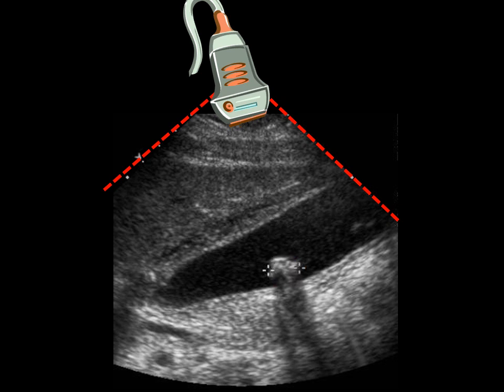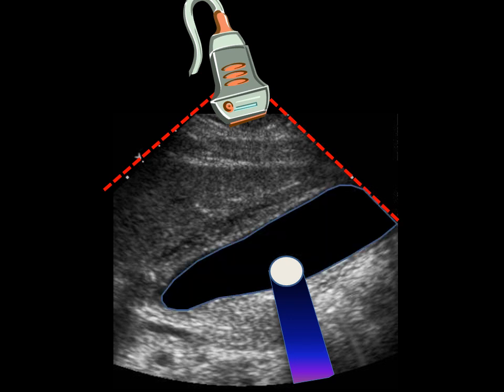The gallstone also creates an acoustic shadow, because none of the sound waves are able to penetrate and pass through the stone. So, distal to the stone, there is acoustic shadowing. The gallstone is within the sonolucent, or echolucent, or anechoic gallbladder, which is fluid-filled.